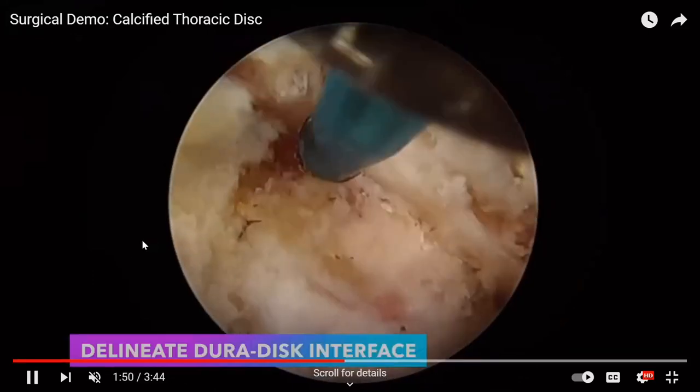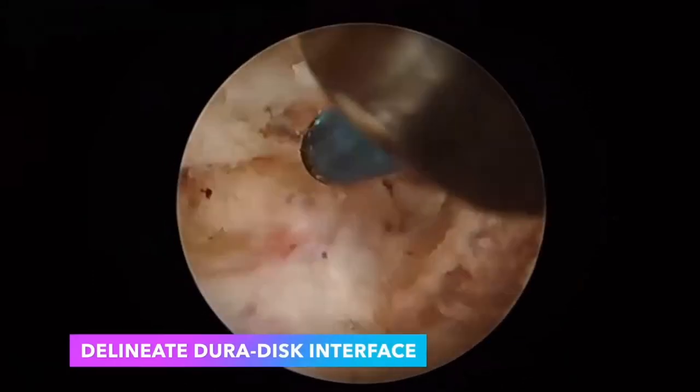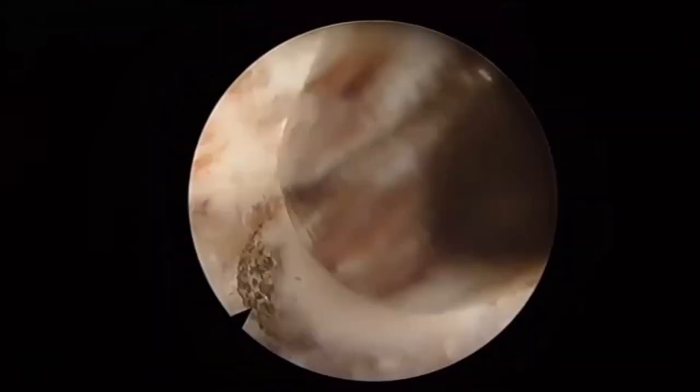You're using this bipolar to get a good plane between your dura, which is super flattened here, and the offending agent, which is the disc. And that's another nice thing about endoscopy. You could use that bipolar coagulation to create planes or to find planes in areas that you don't.